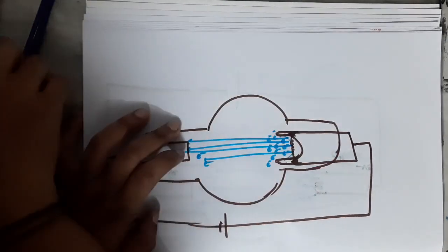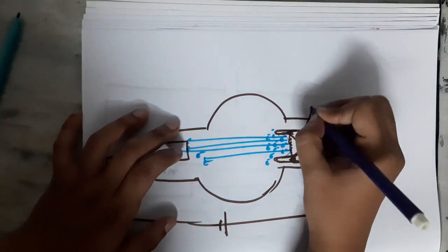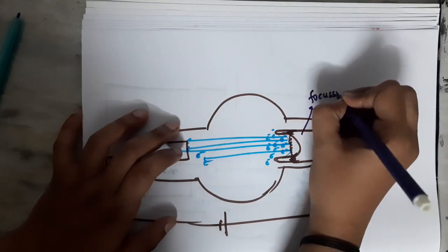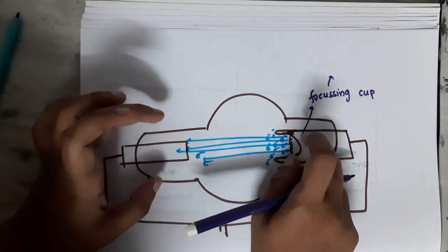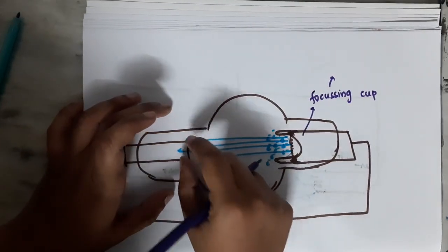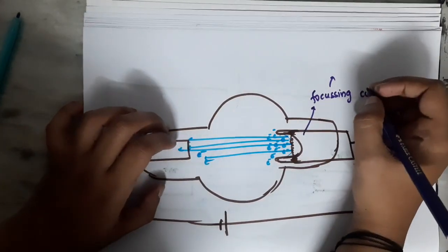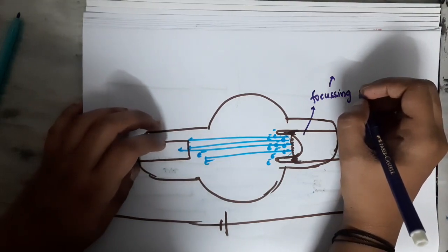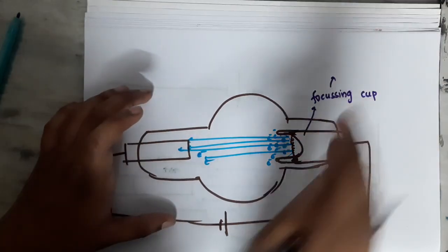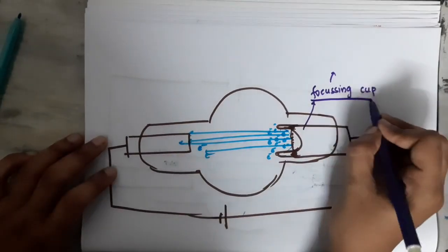What is this focusing cup made up of? This focusing cup is actually made up of nickel. So this is nothing but the focusing cup. It will prevent the electrons from going in other directions, and it will help the electrons focus onto a particular anode, a particular target. So this focusing cup is mainly made up of nickel. This is the important thing about the focusing cup.